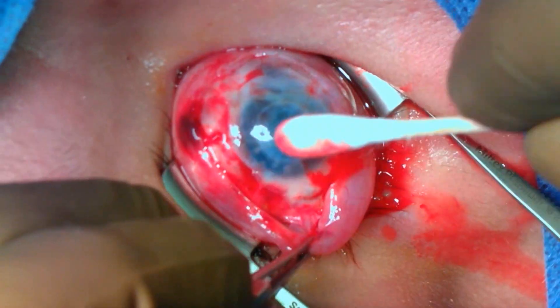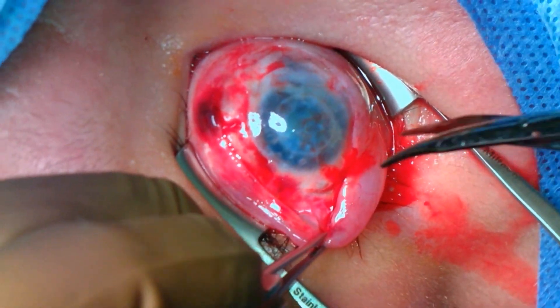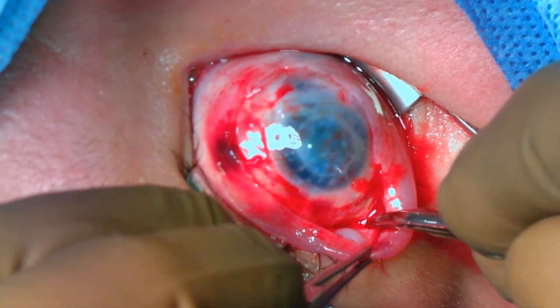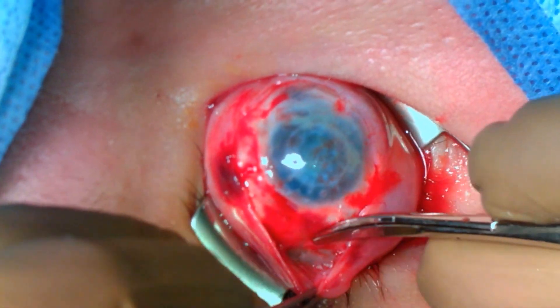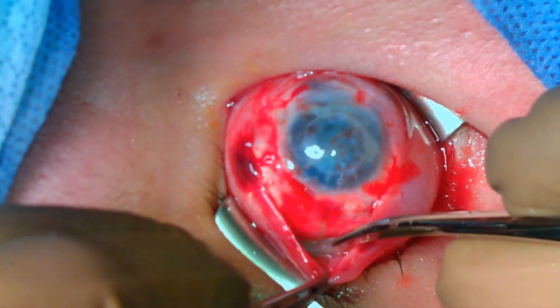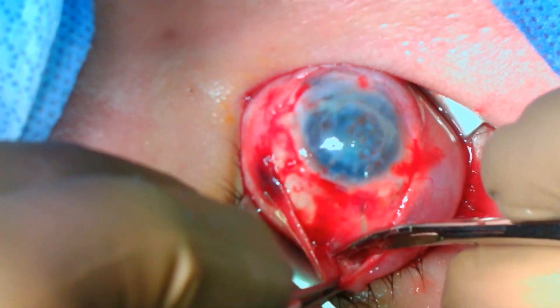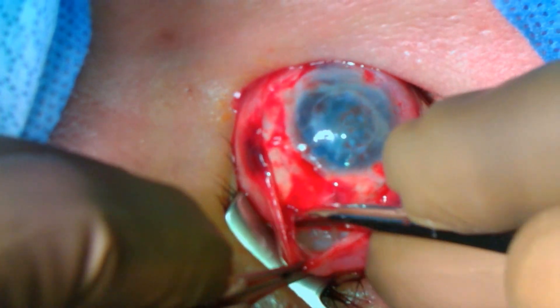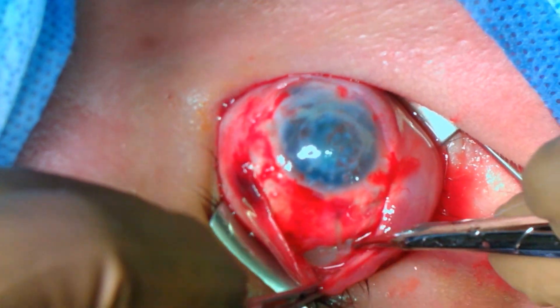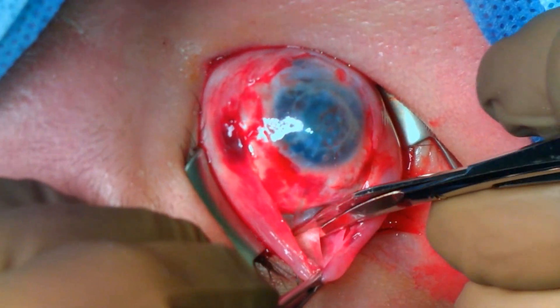A 360 degree conjunctival peritomy is performed and the implant is exposed superiorly. The conjunctiva in these cases can be thin and adherent to the globe due to the previous surgery. Dissection is carried out subconjunctivally along the anterior surface of the implant. The tissue can be adherent to areas of the previously placed sutures.